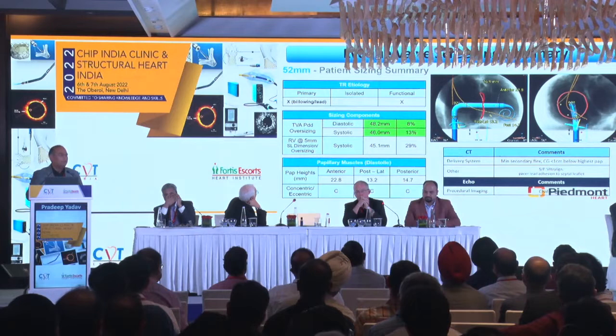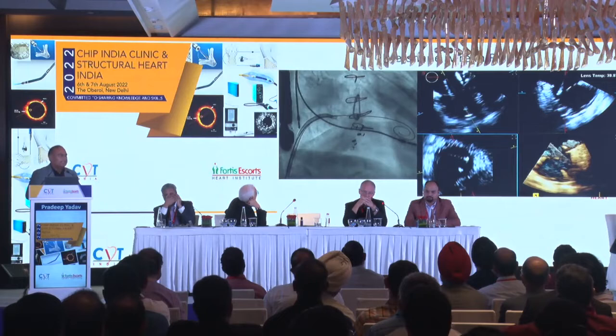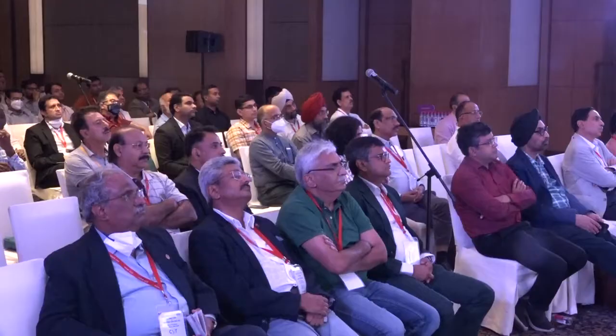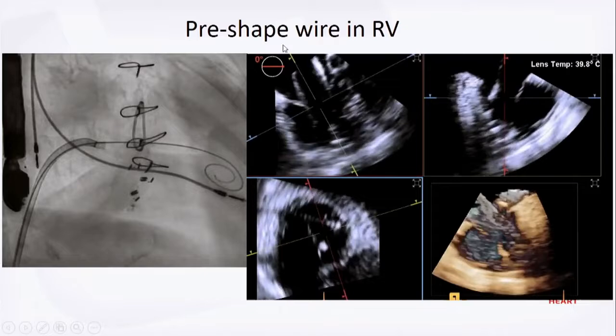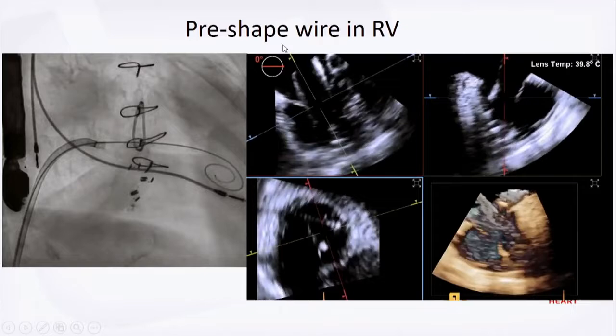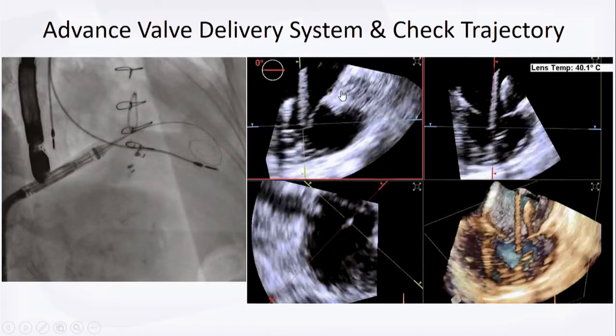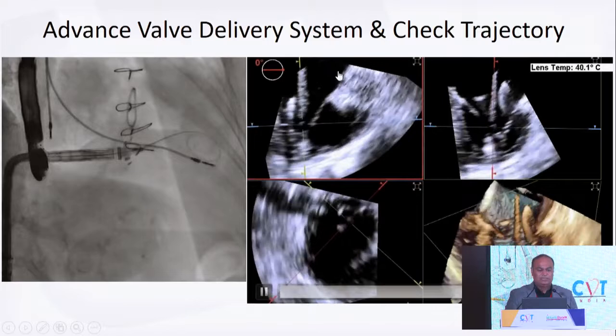Intra-procedural images show the mitral annuloplasty ring, TriLine pledgets, pacemaker lead, and the steerable Agilis sheath through which a Safari wire is advanced to the RV apex. On echo you see the pacemaker lead posteriorly and the Safari wire at the RV apex. Once the Safari is placed at the RV apex, advance the flexion catheter — gently flex and advance while keeping the wire in position.